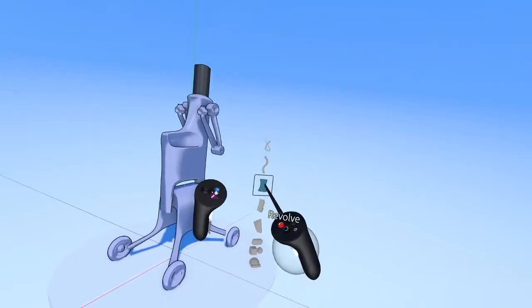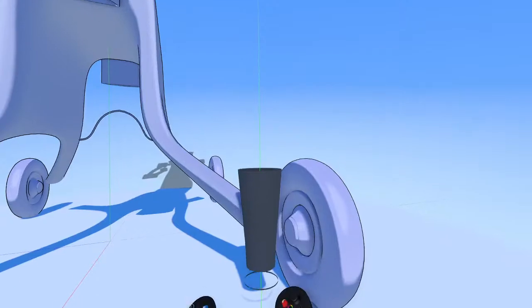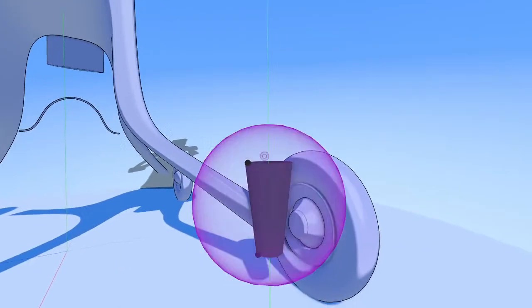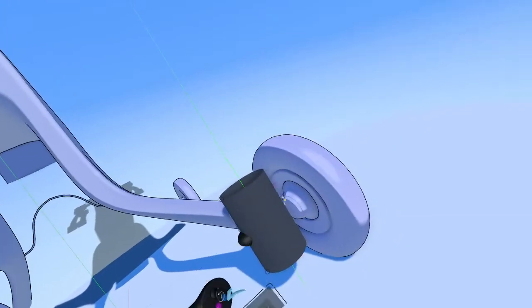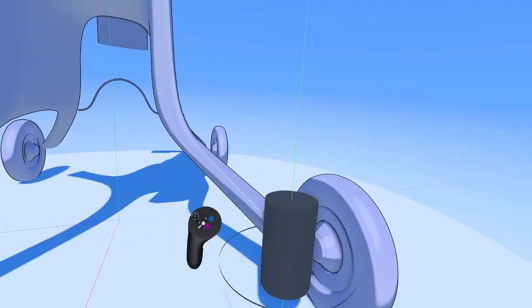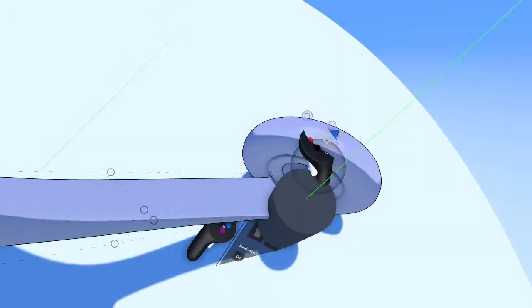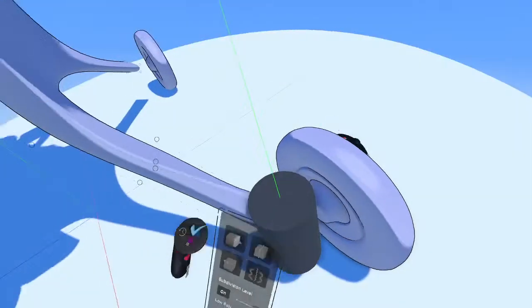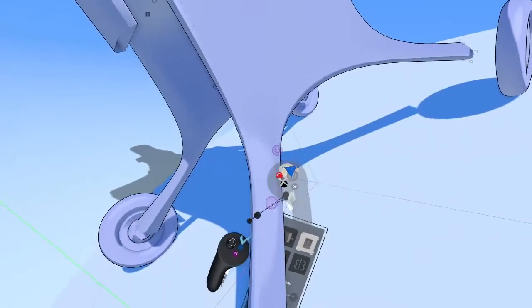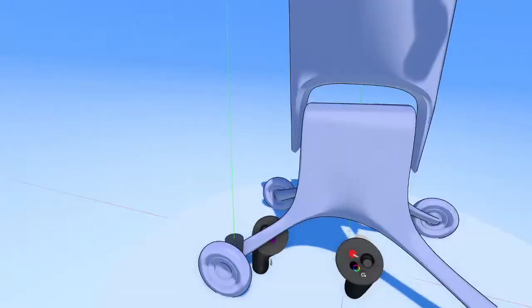All right, and now let's just use some loose geometry here. So I'm going to come down here with the revolve tool, make those pivot points for the wheels, like this, right? If we want to fill in this entire shape, we can go to the graph and adjust thickness there. And then I'm going to match my leg up to fit within that shape, like that.